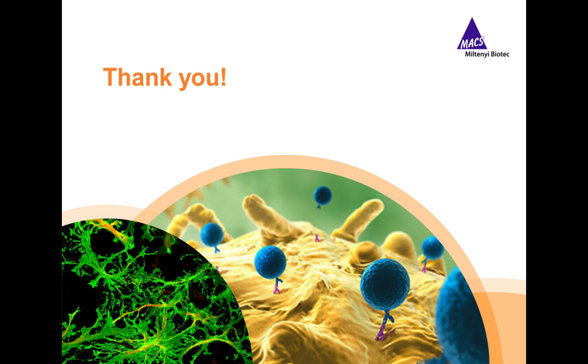Your next question is, how long can you maintain astrocytes in culture with AstroMACS Medium? We tested cultivation for 2 weeks, but I think it's not a problem to cultivate them longer. I think 3, 4, 5 weeks is not a problem, and maybe even longer.